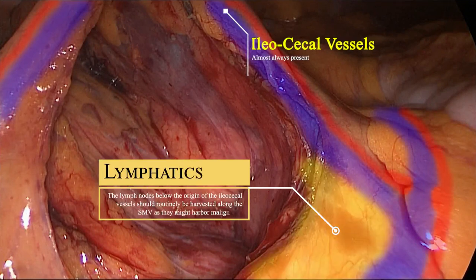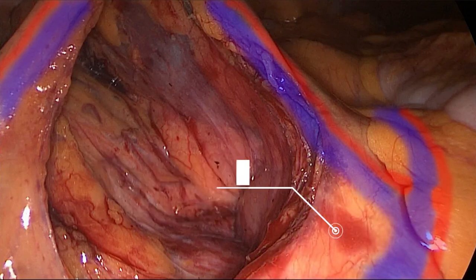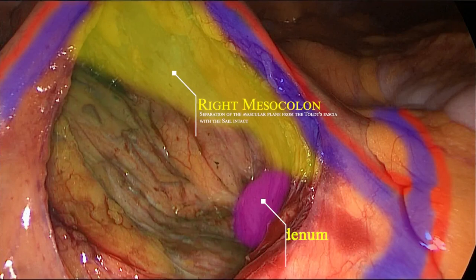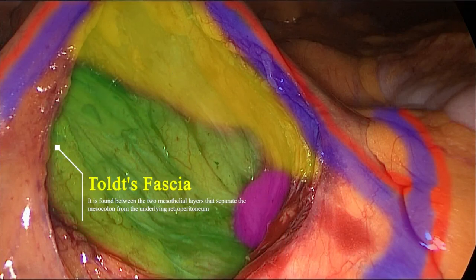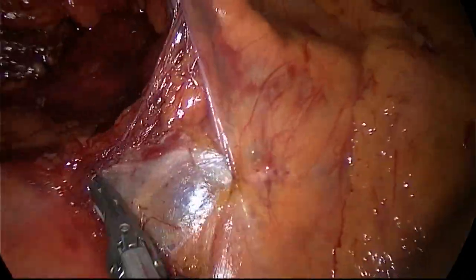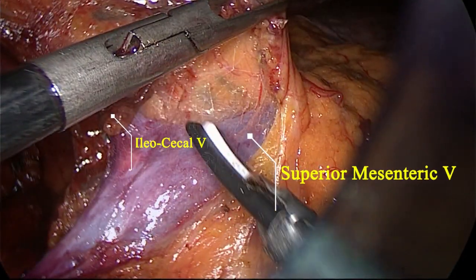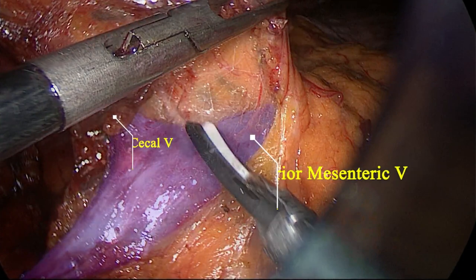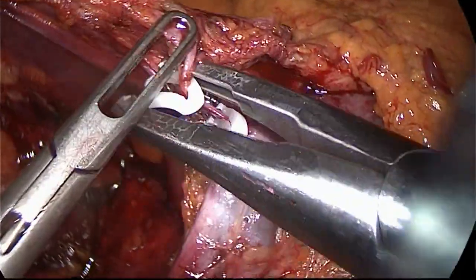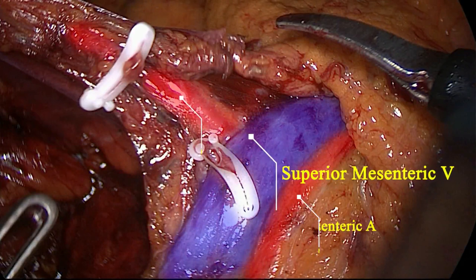The area of lymphatic interest shown here is resected by carrying the dissection towards the first ileal branch of the superior mesenteric vein and then heading towards the confluence with the ileocolic vessels. This area represents a common place of lymphatic metastasis and should always be included in the specimen, especially when the tumor is located in the cecum.